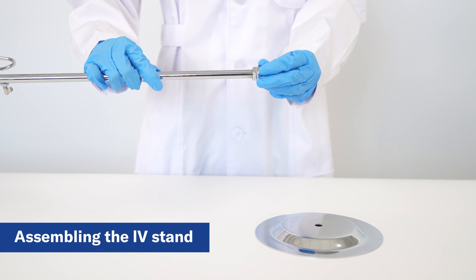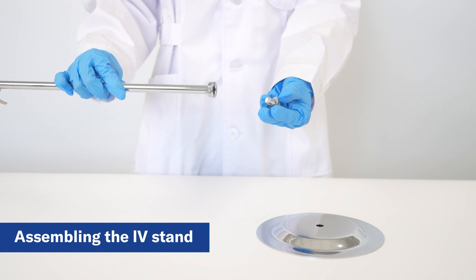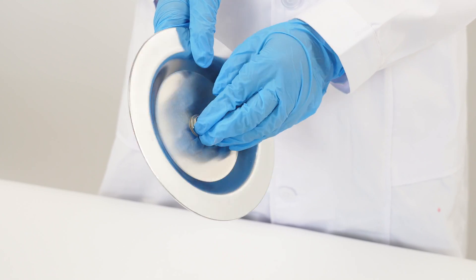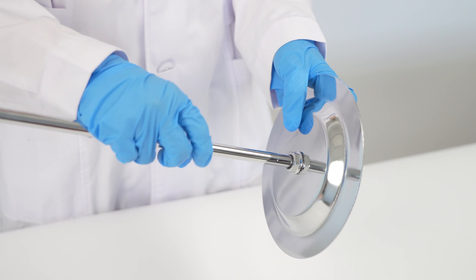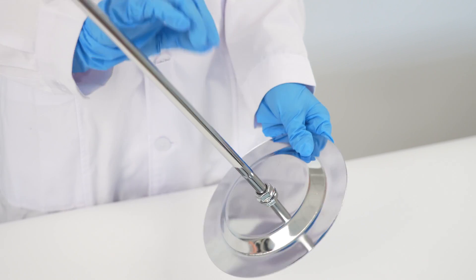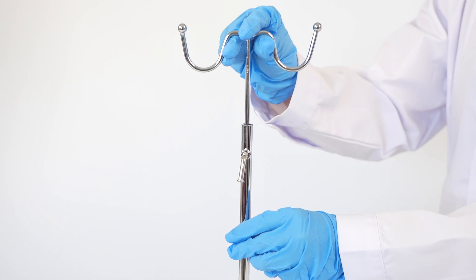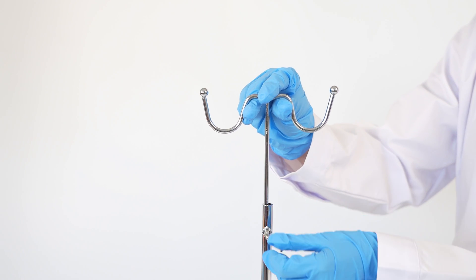Now let's assemble the IV stand. Start by removing the plastic nut and washer from the stand. Then connect the stand to the base or foot piece and tighten the nut firmly by hand. Adjust the height of the stand to your desired position, ensuring it's stable and ready for use.